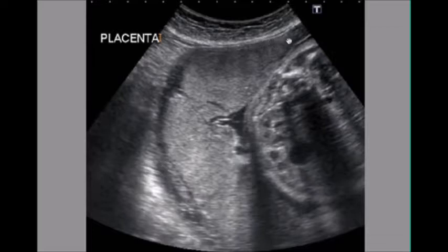This is an example of what we call a fundal placenta. This is the very top of the mother's womb, okay? And this placenta is stuck right at the top. So this is called a fundal placenta. This is exactly the opposite of where the birth canal is. So this is good. This placenta is not going to be obstructing the birth canal.